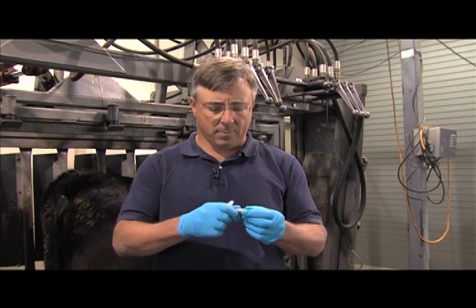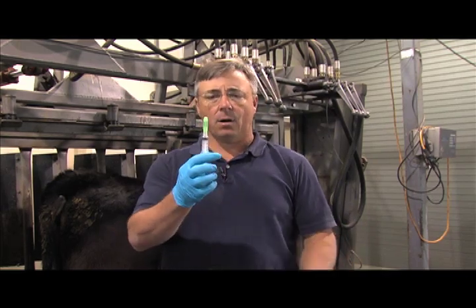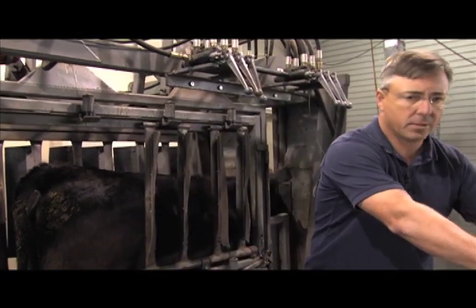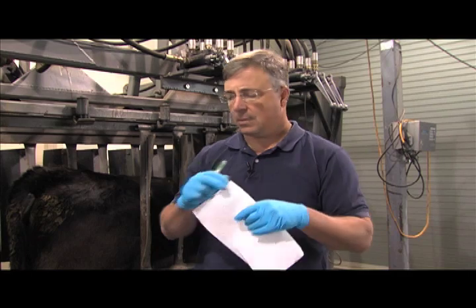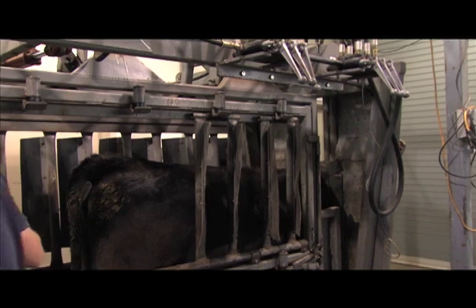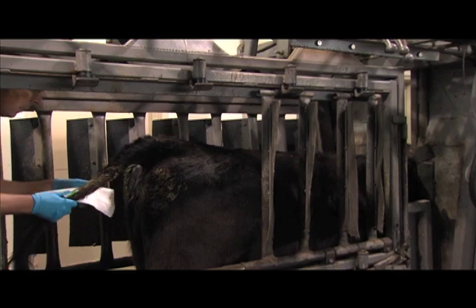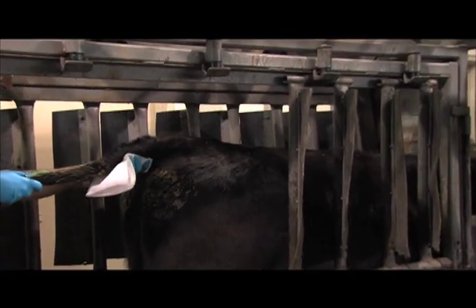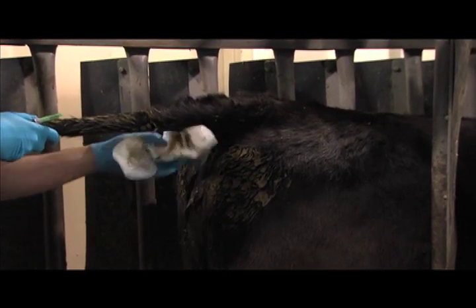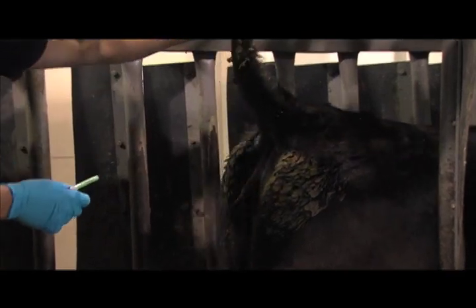The first step in obtaining a tail blood sample is to put the needle on the syringe. Second, you'll get your paper towels, restrain your animal, and we'll get in behind the animal to take the blood sample. First, you take the paper towel and you'll clean the underside of the tail. Get it as clean as you can, and you'll take the tail and you'll bend it straight up.